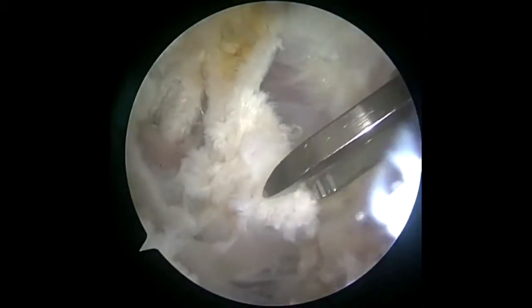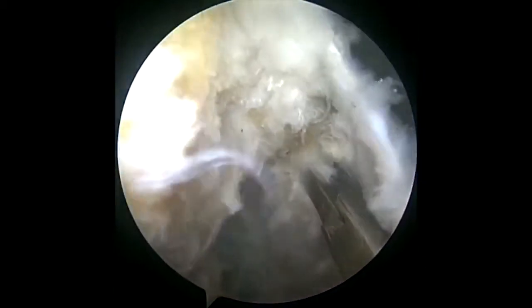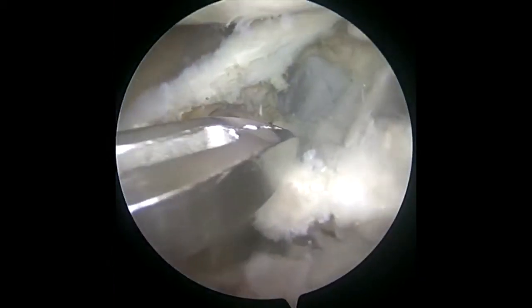The subscapularis tendon remnant is released, and if tension-free repair cannot be accomplished to the native footprint, we proceed to the ACR technique. We begin with clearing out the space and preparing the bed for the graft. The rotator interval is widely open. The coracoid and conjoint tendon is identified and lesser tuberosity is completely exposed. Once it's done, the anterior glenoid neck is biologically prepared.